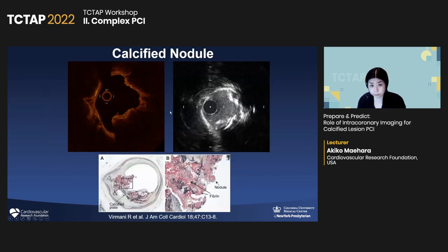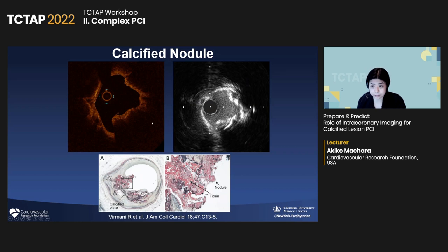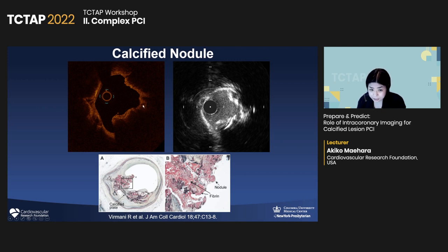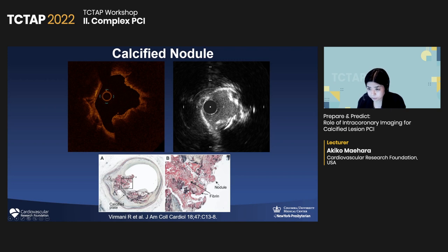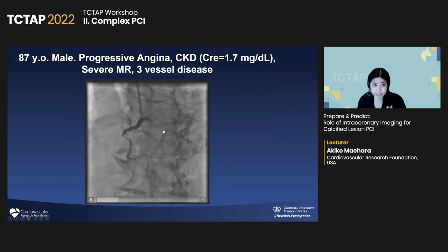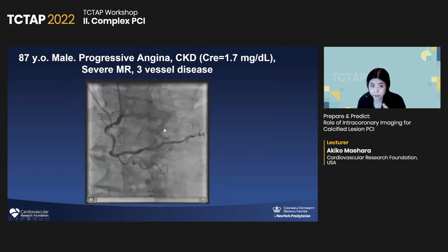Lastly, we are learning more and more about calcified nodule. This is the same case by OCT and IVUS. The first thing: don't confuse the calcified nodule with red thrombus — many times it's confusing. But if you look inside, there is calcium. That's the calcified nodule. Many times you see the calcium plate behind. The calcified nodule is an accumulation of small nodular calcifications. This is a case: an 87-year-old patient with CKD. After atherectomy, the stent was implanted with nice stent expansion. But the patient came back two months later and angiographically it looked like a thrombotic event.